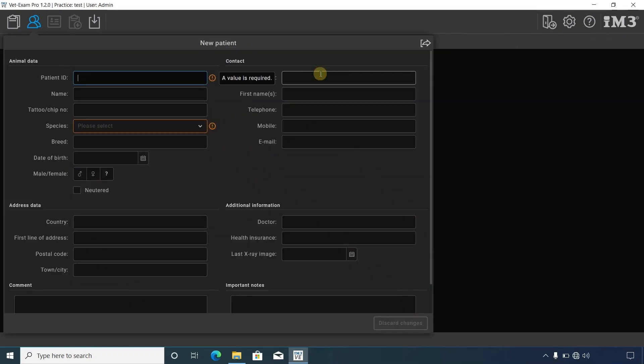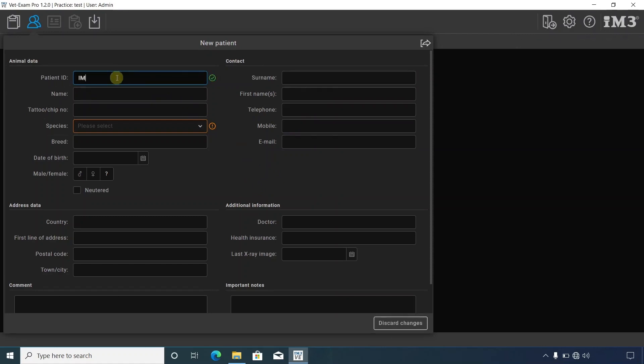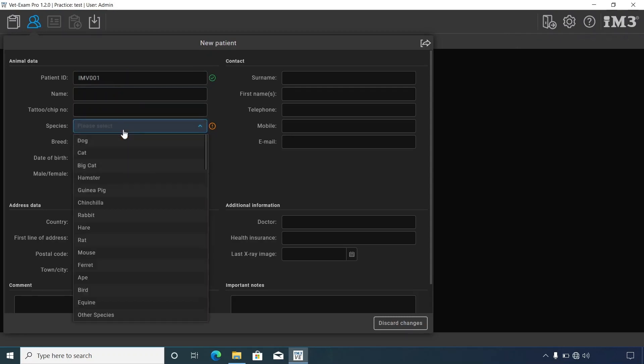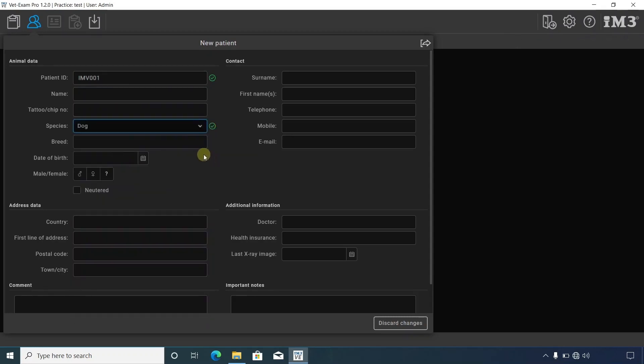You must enter patient ID and species as a minimum, highlighted in the orange boxes. To save changes, select close, or to discard any changes, select discard changes.